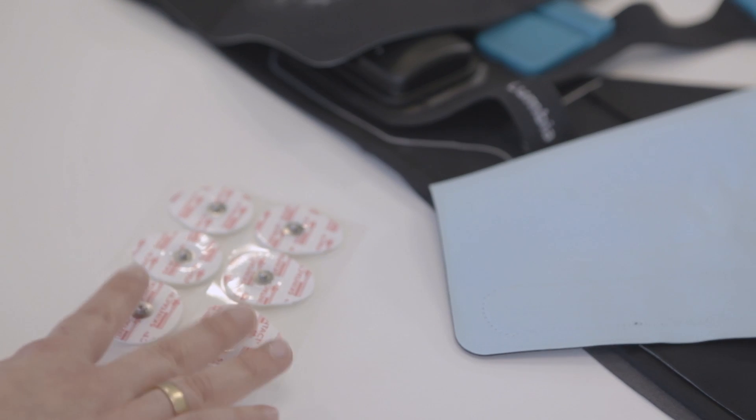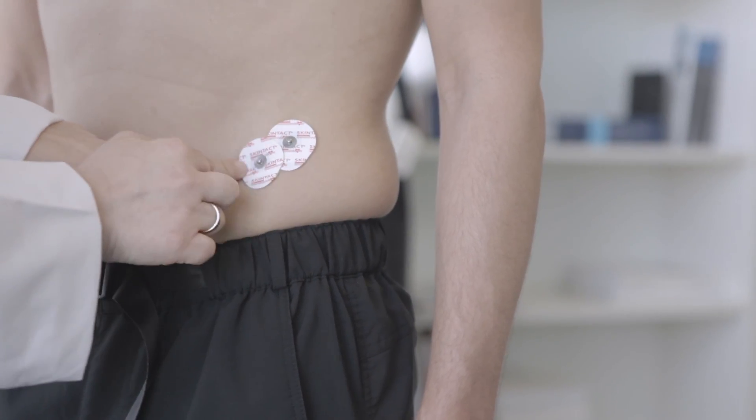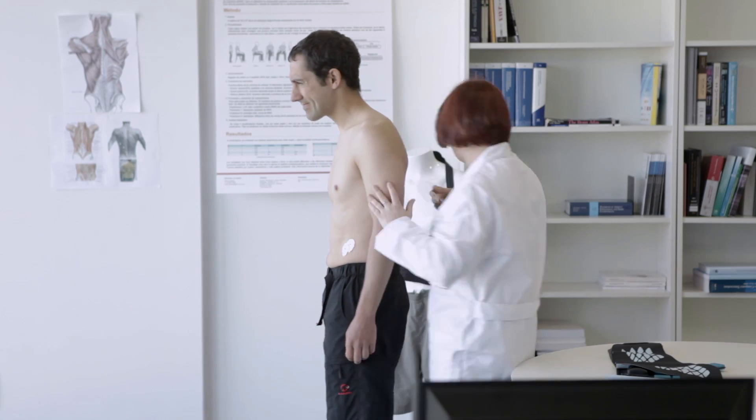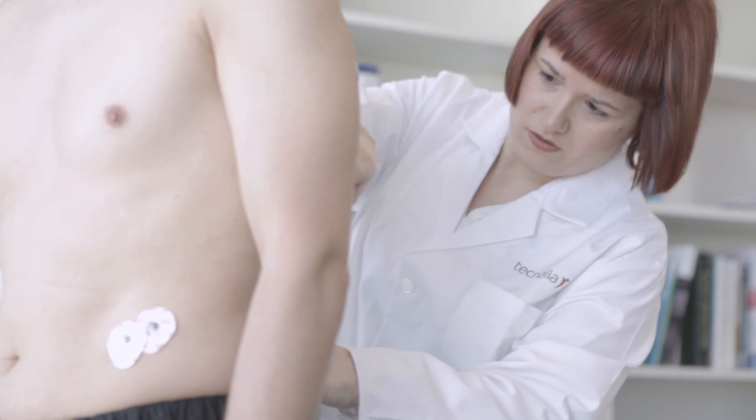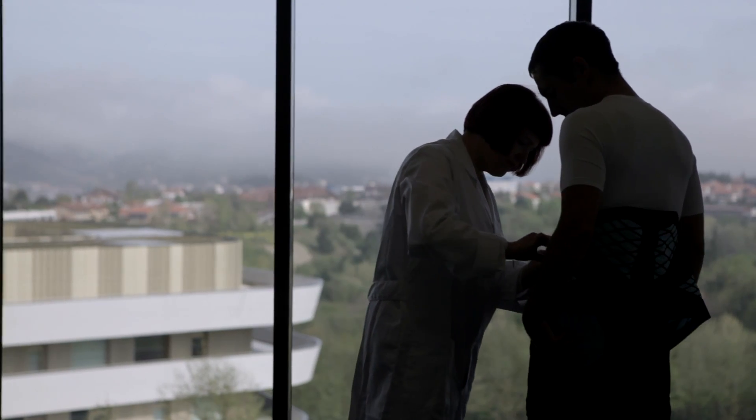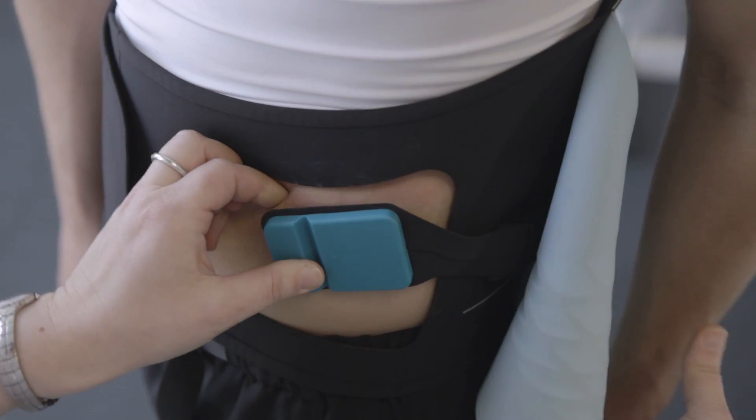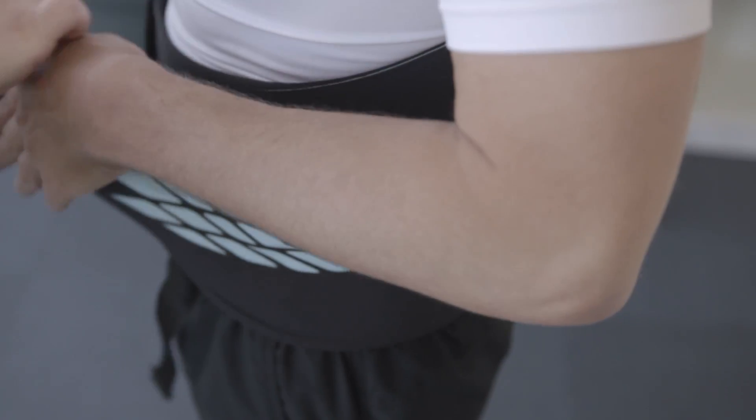Lumbia is a non-invasive tool that can be used during educational interventions, back training programs and clinical assessment. In populations with a higher risk for developing lower back pain, Lumbia can be used as a postural re-education tool, even if no back pain is present.